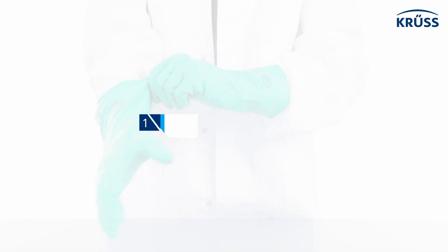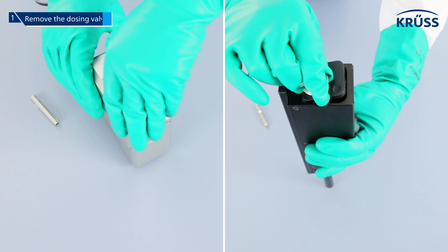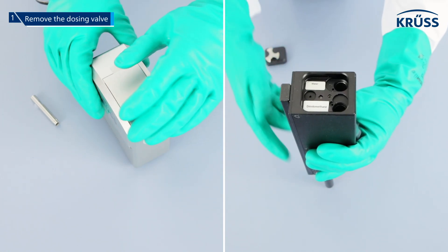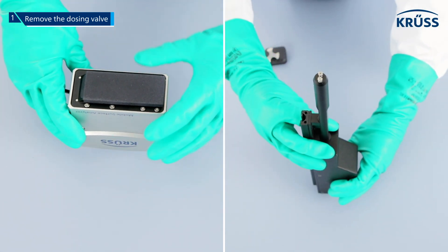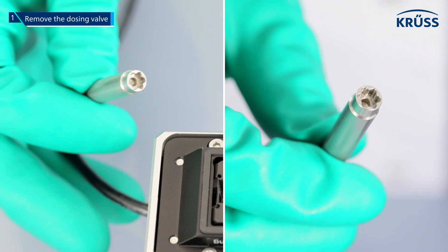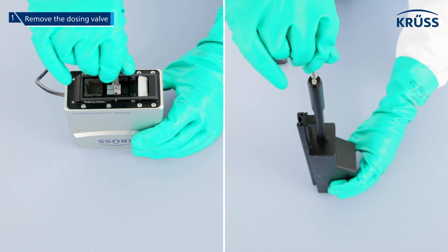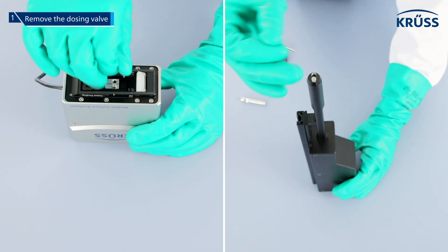Step one: remove the dosing valve. Make sure that no cartridges are present in the pressurized dosing unit. Turn the MSA or DS3252 module upside down, unscrew the dosing valve using the supplied valve wrench, and remove the valve.